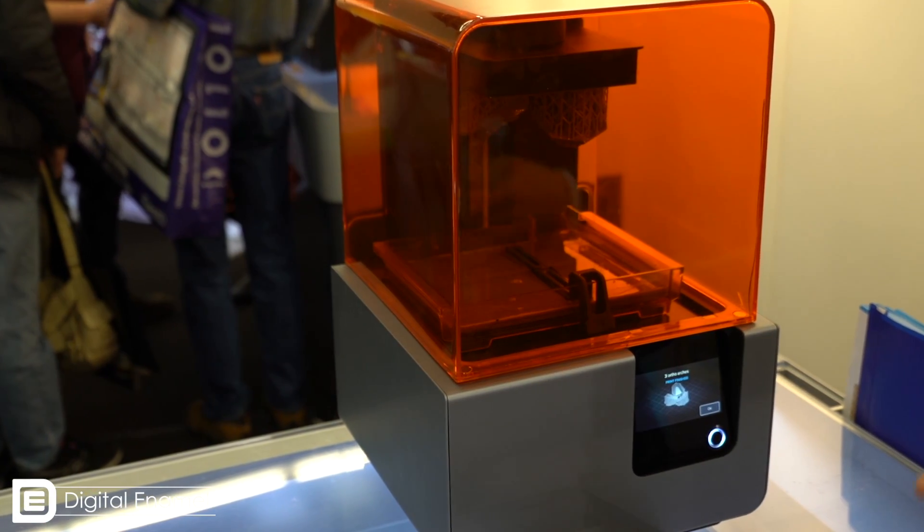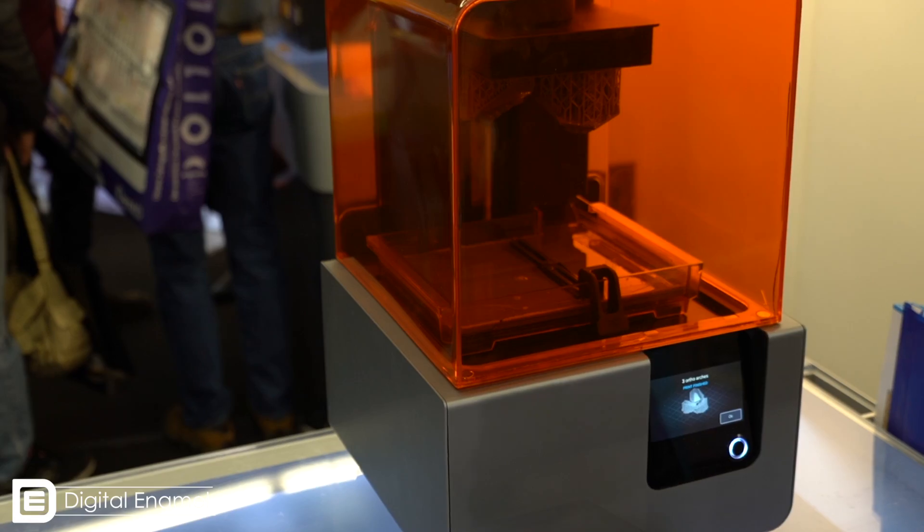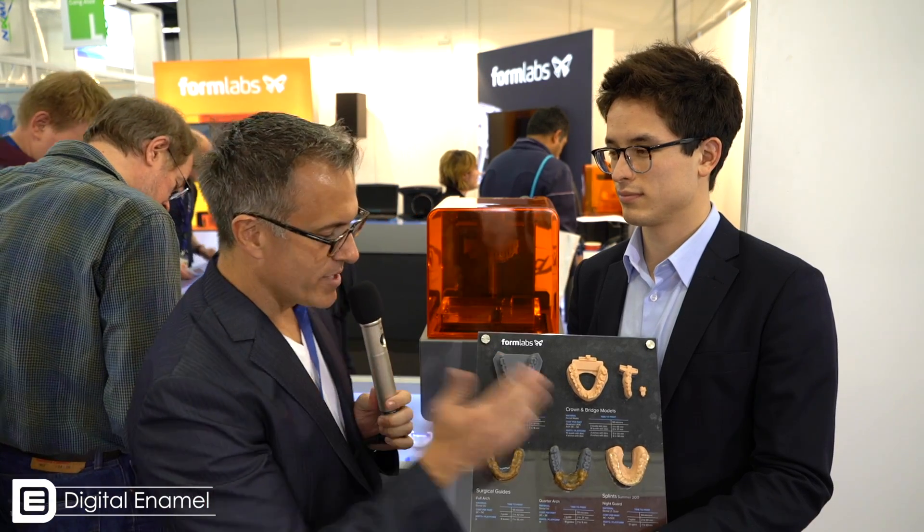Formlabs is coming out this summer with a clear splint material. I'm excited about using it for nightguards, but also for surgical guides. It's not a big deal to have an amber-colored surgical guide, but I'd really like to have a clear guide, so this is great.